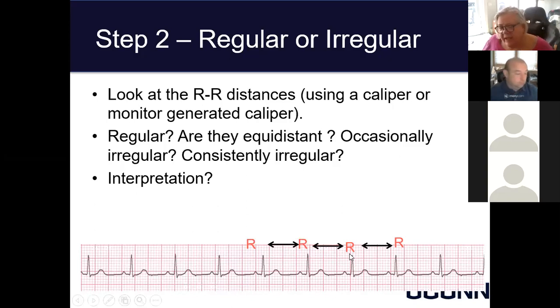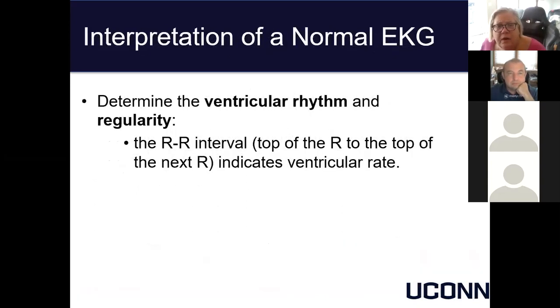And you know, if you don't have calipers, you can always take a piece of paper, mark one, mark a second one, and then move the paper along for practice. And again, the other option is when you go to clinical, try playing with the electronic calipers to see how those work for your patient.